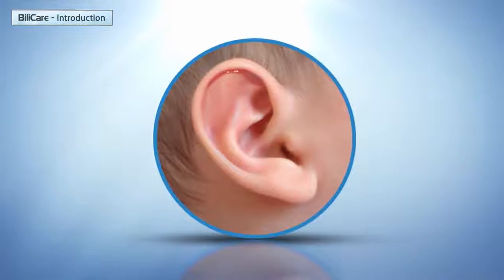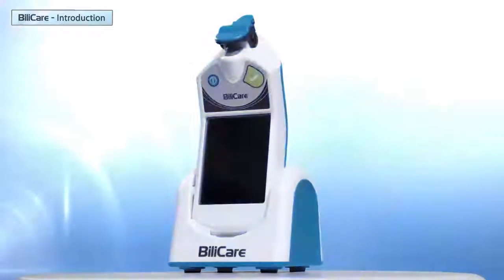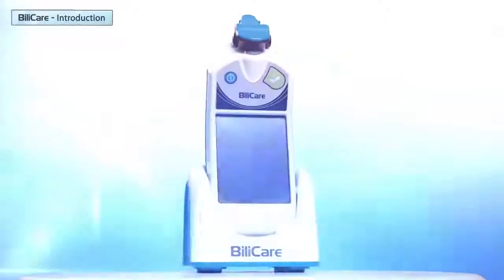The sensor should be positioned only on the upper side of the ear in the scaphoid fossa, in the place where the thickness is most consistent. Avoid placing the sensor on folded or malformed locations or any other body parts.